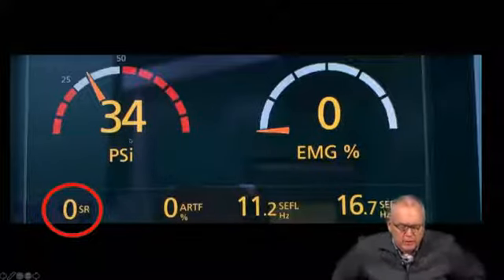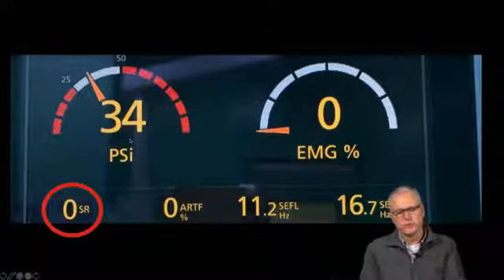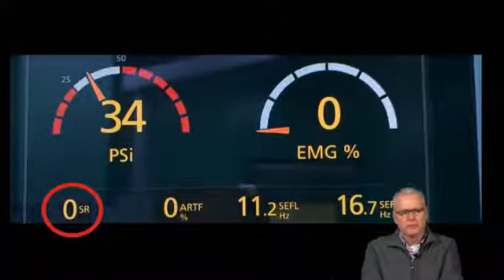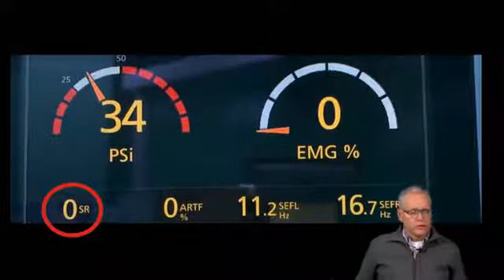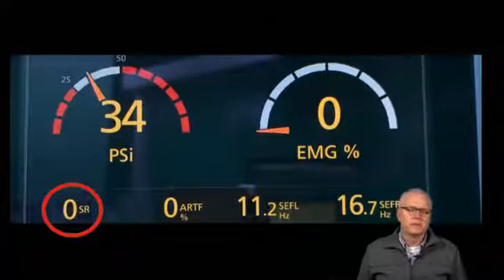Indices are somewhat challenging for clinicians to use because they're stochastic instead of deterministic. What I mean by that is they're predictive. They're not an absolute measurement. Not only that, they are usually a black box. The technology used to generate the index is proprietary.